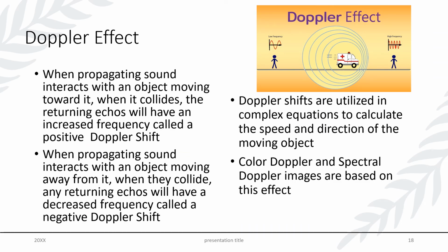The Doppler effect, as I mentioned, we are able to apply that overlying color to demonstrate motion, or that motion on our spectral analysis, all because of the Doppler effect. And the Doppler effect is something everybody's pretty familiar with. You know, this is really common with radar guns. If you're speeding towards a policeman, they utilize the Doppler effect to determine how fast your velocity is.